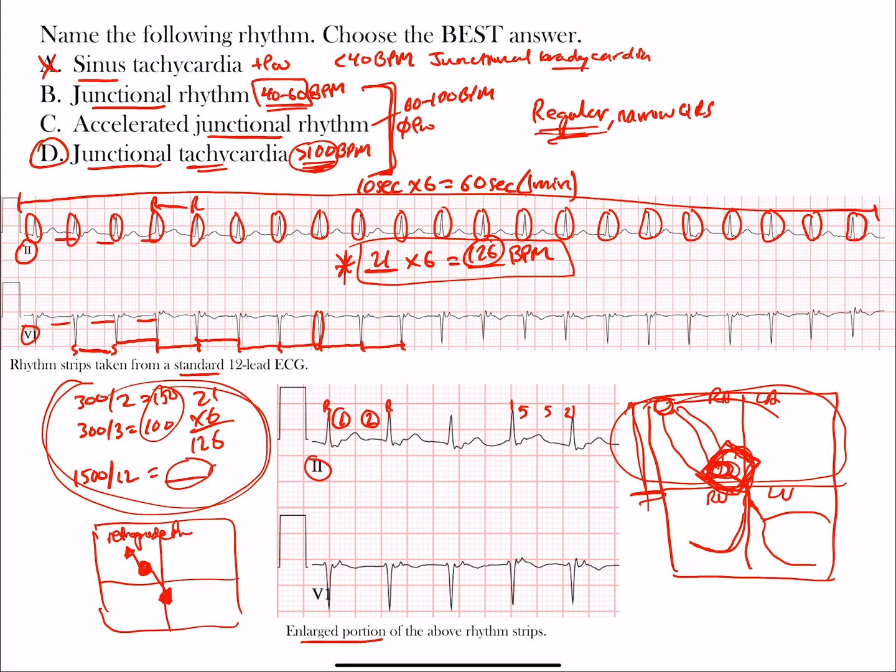You have conduction going antegrade forward to the ventricles and backwards retrograde. That's why sometimes you'll see inverted P waves - these may be retrograde P waves here in lead 2. Because conduction is going down to the ventricles and backwards, it's often buried within our QRS complex and we may not see those P waves.